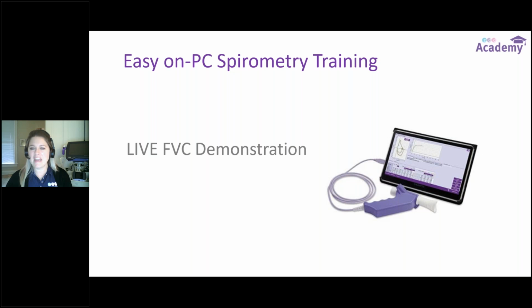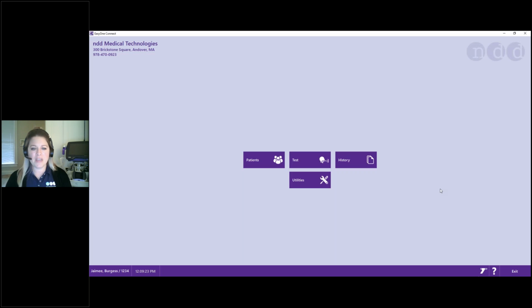All right, I'm going to go ahead and click over to the PC software so you guys can watch along with the software while I'm testing myself. So I am going to switch over. Now you guys should be viewing the Easy One Connect software. I am going to have my disposables. I'm going to have my Spirette mouthpiece. I'm going to have my nose clips. And then I have my Easy on PC spirometer. So the Spirette inserts into the spirometer, lining up the arrows. You're going to have your patient sitting.